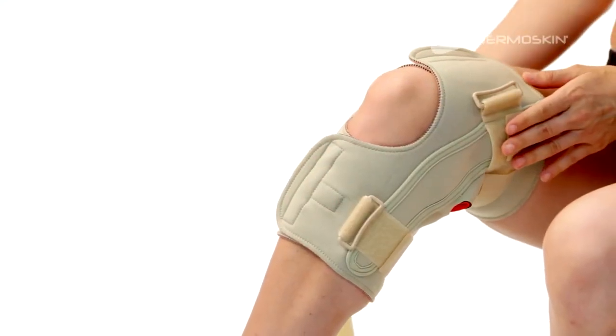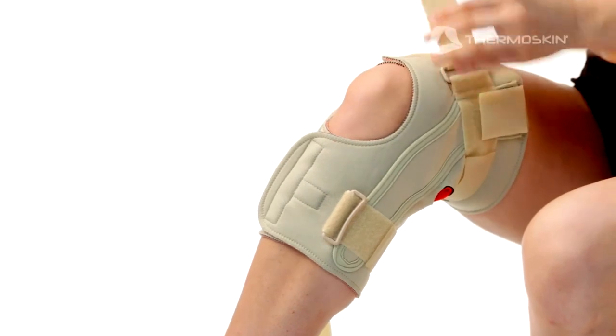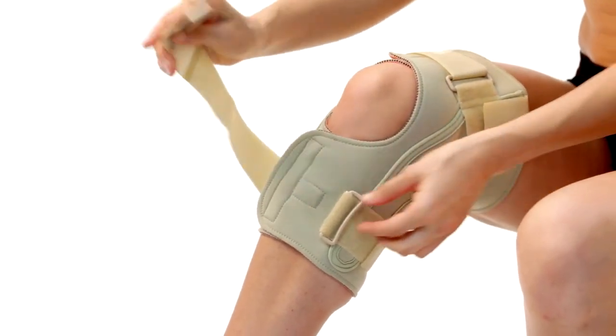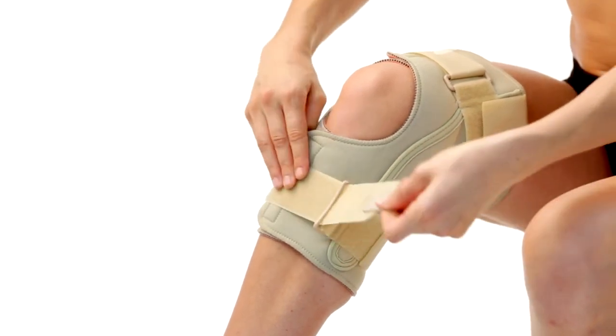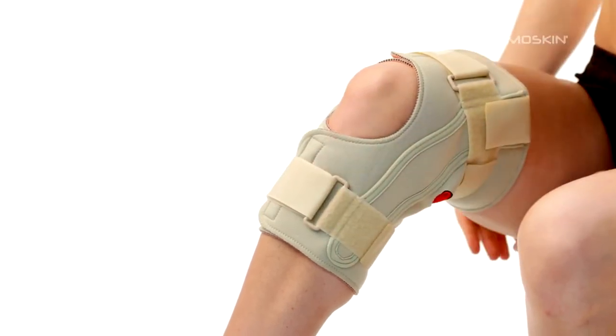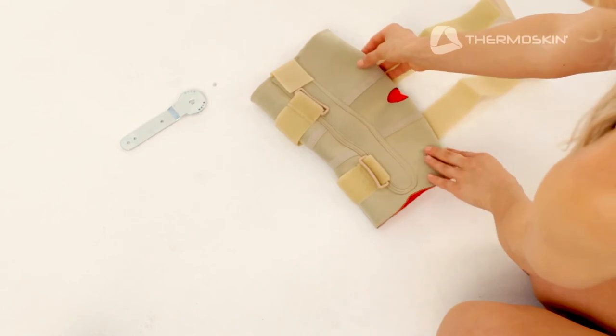Then thread the long top strap through the top buckle and back on itself, firmly securing the fastener to keep the brace firmly but comfortably in position.